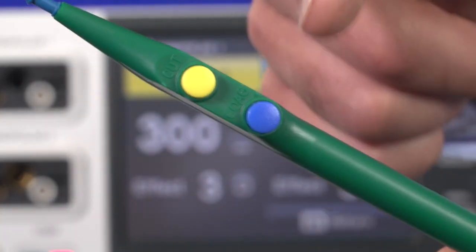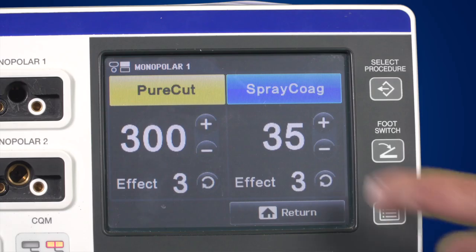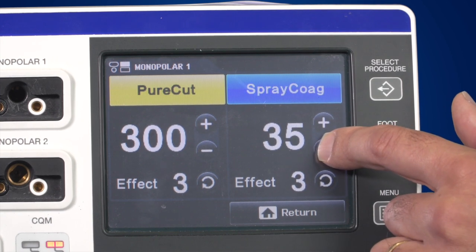The colours correspond to switches on the instruments. If you connect only one instrument to the generator, it is advisable to only have this instrument show up on the display. To change the maximum output power, press the plus and minus buttons accordingly. You can also change the effect setting. If the output power is too high or too low, changing the effect setting is the first step you should take, then fine-tune it further using the plus and minus buttons.